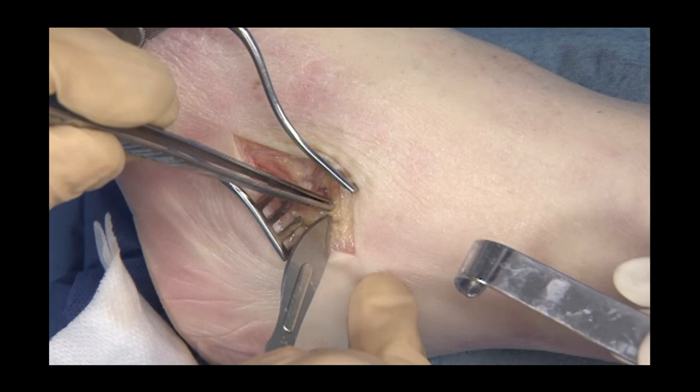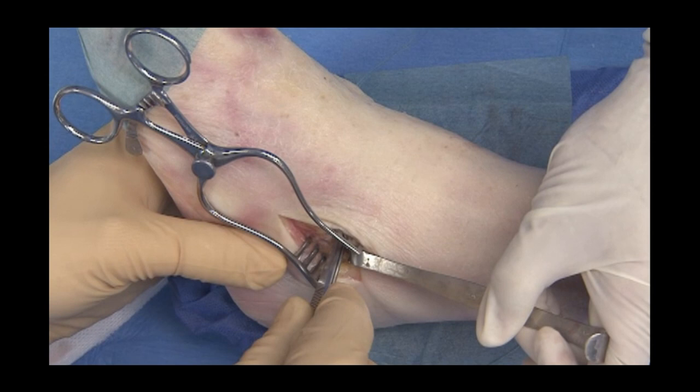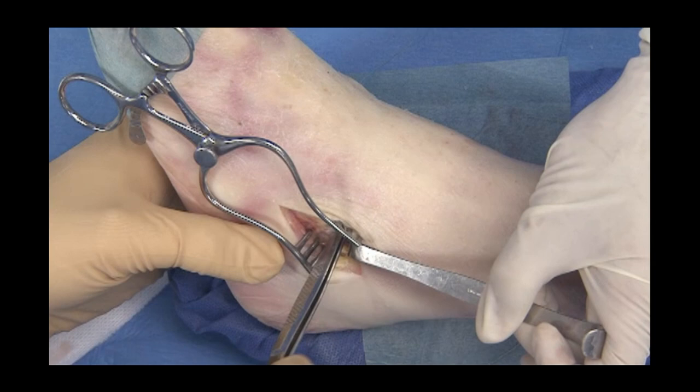The subtalar joint is identified. The interosseous ligament is controlled. The forceps is positioned posterior to the ligament and anterior to the posterior facet, all the way to the medial side through the sinus tarsi.